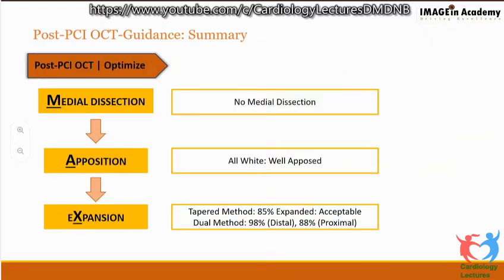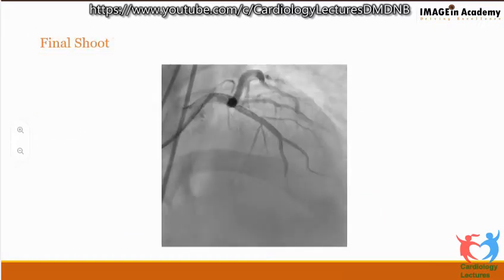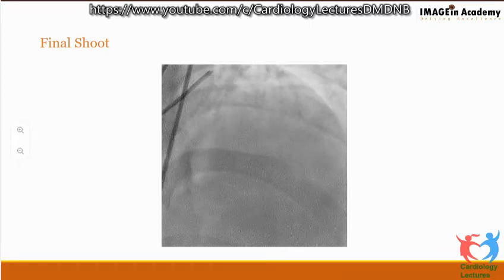So we have no dissection. The stent is very well apposed. And if you see the expansion, on the taper method it appears to be 85% and on the dual method 98%. So it is a well expanded stent, and we need not do anything. And this was the shoot of the vessel.